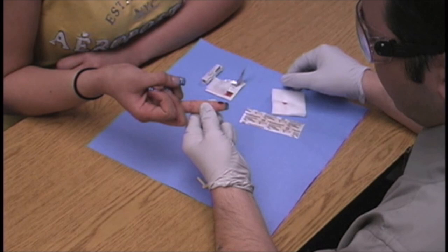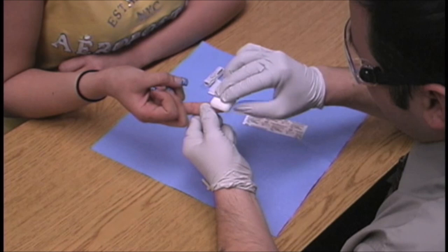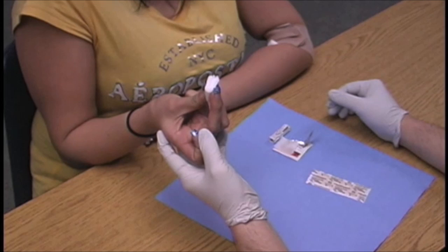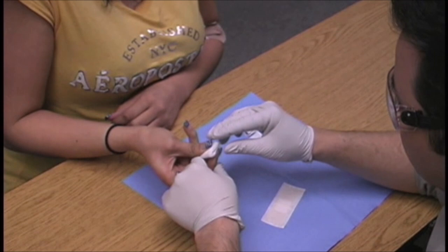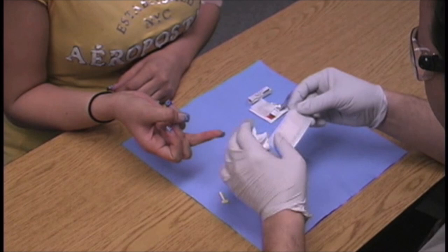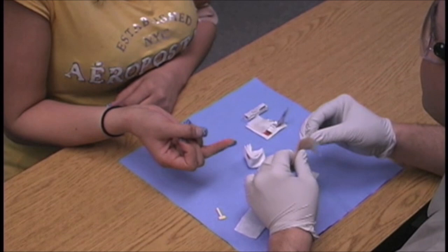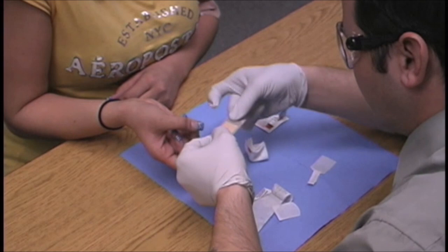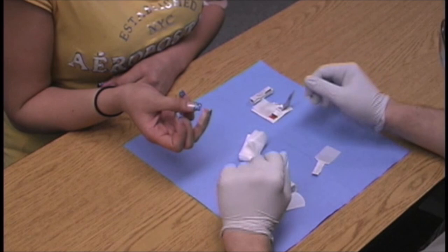Once the test is over, Al picks up the gauze, folds it into quarters, and hands it to the patient. The patient uses their thumb directly over the top of their finger to apply pressure. After three to five minutes of pressure, Al lifts the corner of the gauze to confirm bleeding is controlled and stasis is achieved. He then places a band-aid over the end of the finger. Even for a skin puncture, check that your patient is okay — observe for pallor, cyanosis, tachypnea, tachycardia, and diaphoresis. If they appear to be fainting, have them put their head down, take slow deep breaths, and call for help.